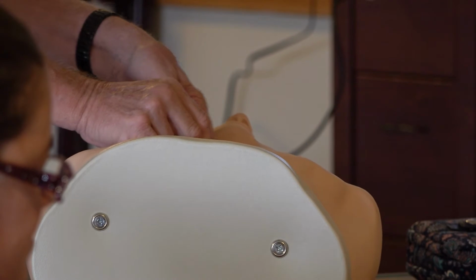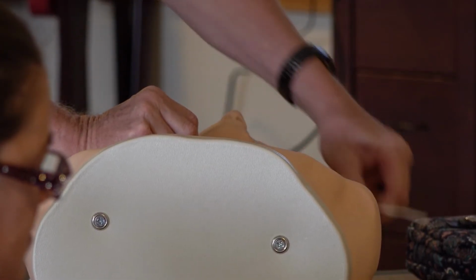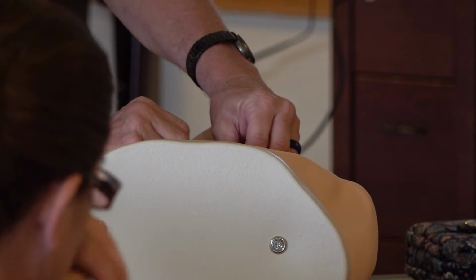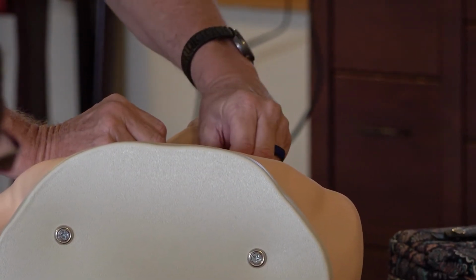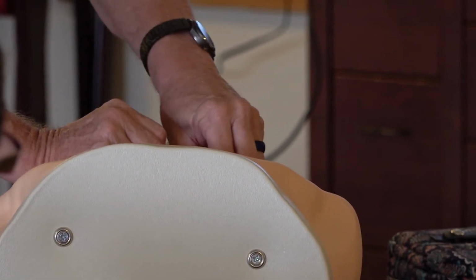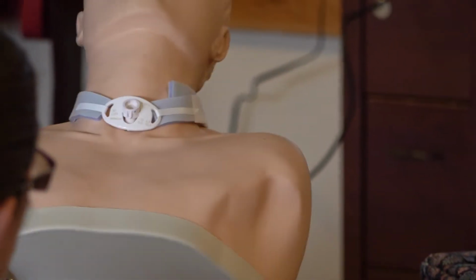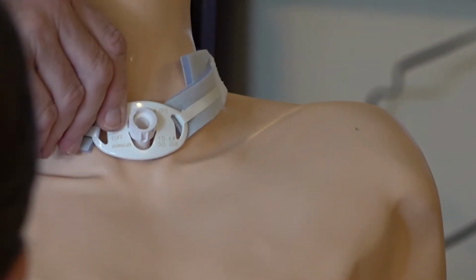And now I'm going to go to the other side and do the exact same thing. I'm going to release the old one, lay it down. I'm going to grab the new one, come back up, reinsert on this side. My fingers ain't wanting to work right today. Feed it through and attach.